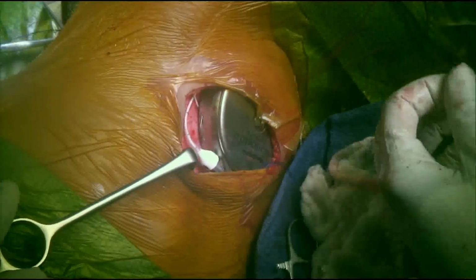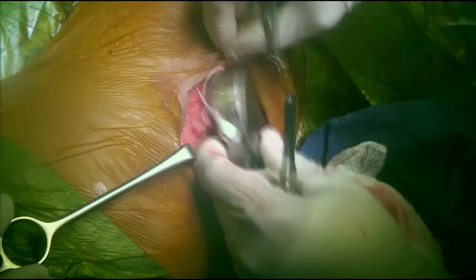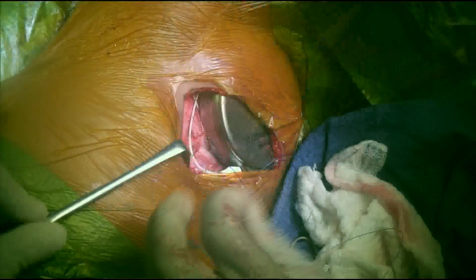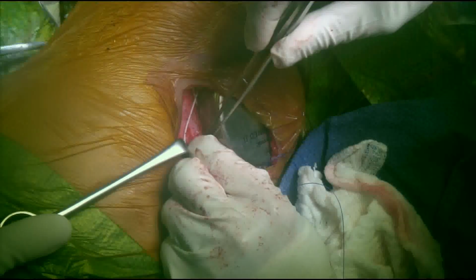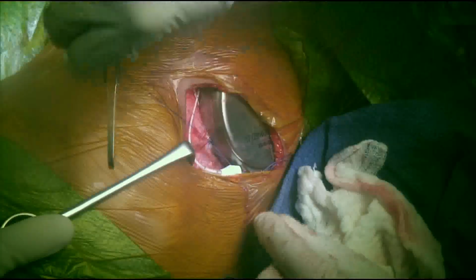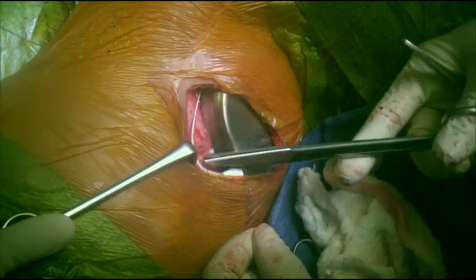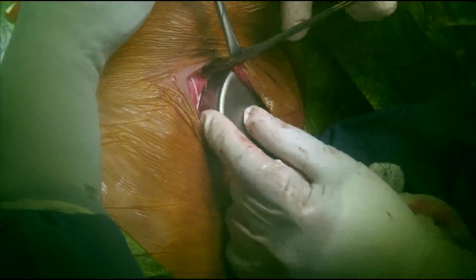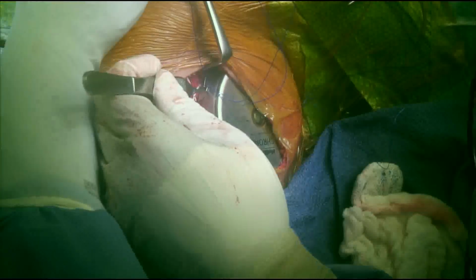As you are watching the process of fixing the baclofen pump to the abdominal wall using interrupted sutures, please remember to watch the first part of this video series. The first part talks about the intrathecal baclofen test dose, where we talk about the indications and some of the methods for deciding which patient should be getting a pump and in which ones it is contraindicated.